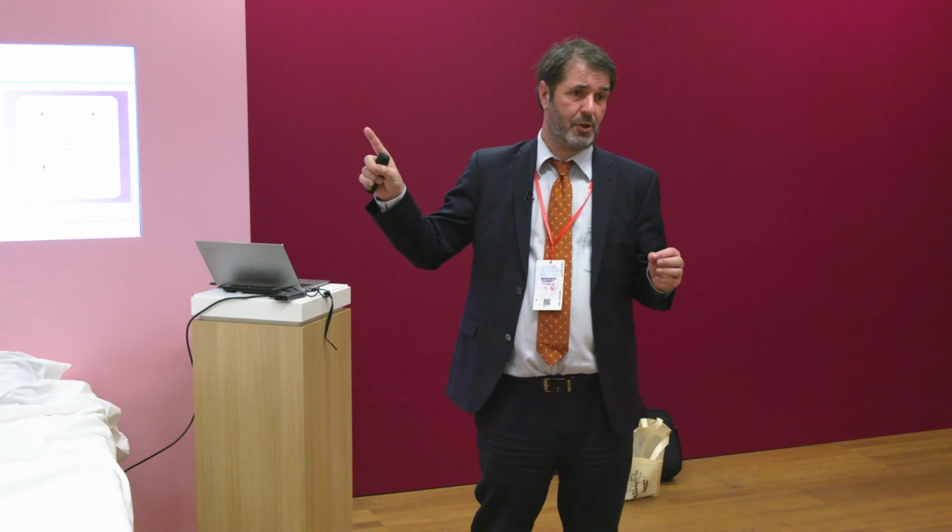You mark this lesion, the mark is on ultrasound, and then you can puncture directly on ultrasound with the help of MRI where you see where the lesion is. Because around about 30% of all prostate cancer are not visible in grayscale. They have the same grayscale. But with the marker, you know, even if you don't see it, you just bring your needle to the marker and then you got it.